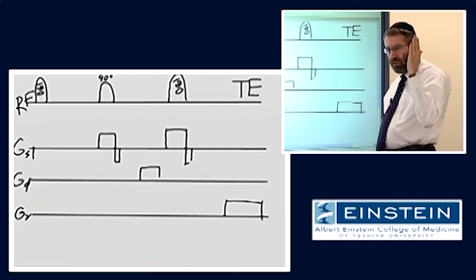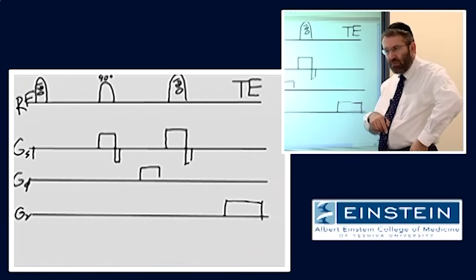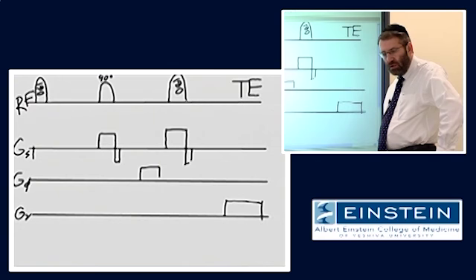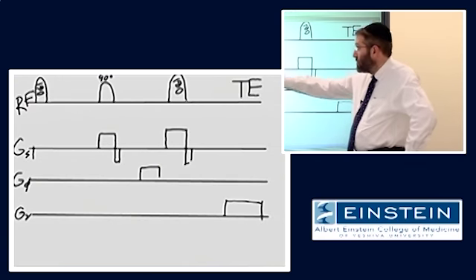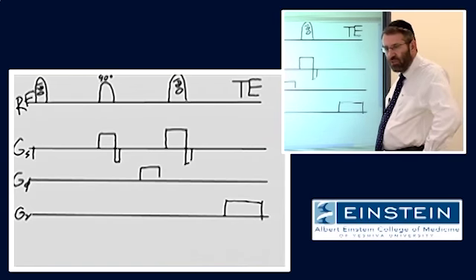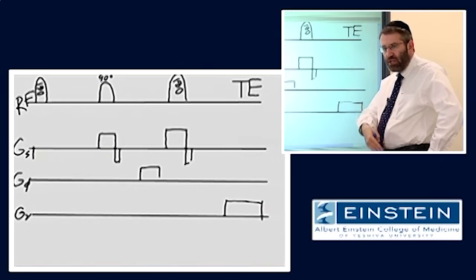Because if you think about it, we're at 180 with no net transverse magnetization, no phase coherence. If we're just observing what's going on and not applying any additional RF, any additional energy, we cannot generate any net transverse magnetization, any phase coherence that isn't there already.